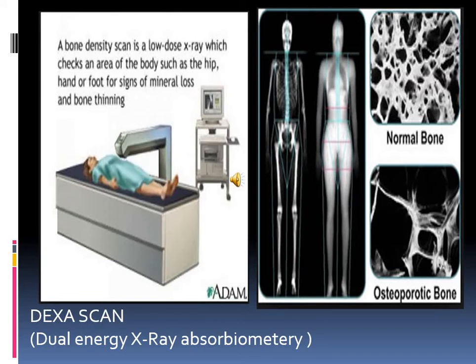Usually, we study osteoporosis with a DEXA scan. DEXA scan is dual energy X-ray absorptiometry, which is very effective for studying generalized bone density and lastly for the diagnosis of osteoporosis.